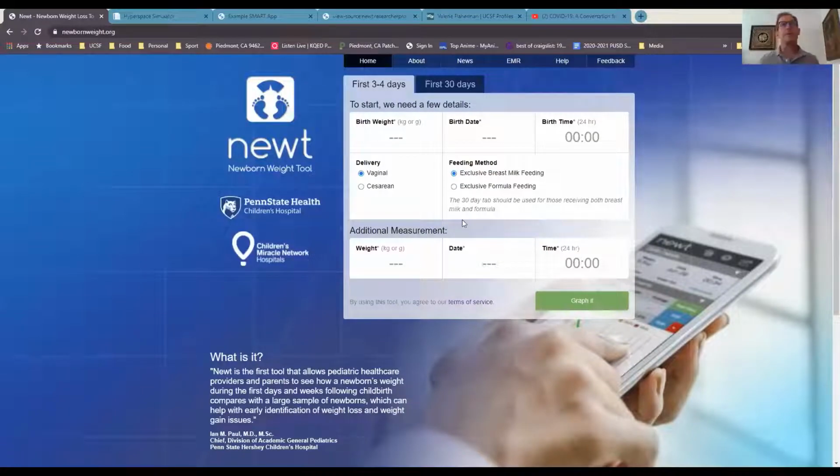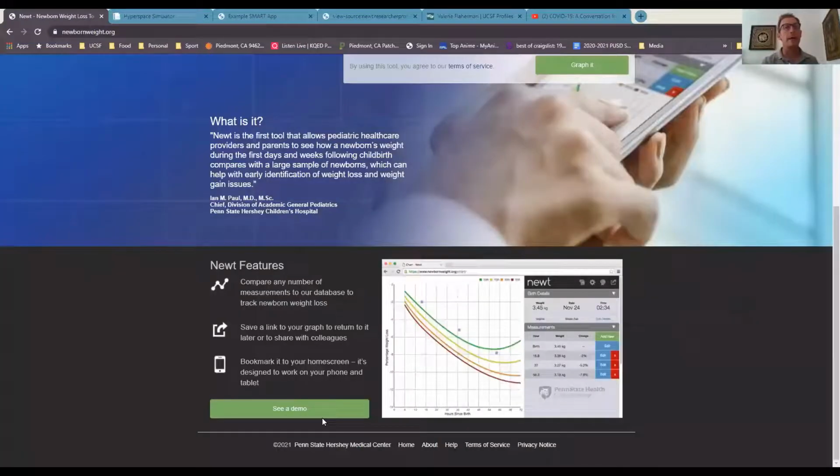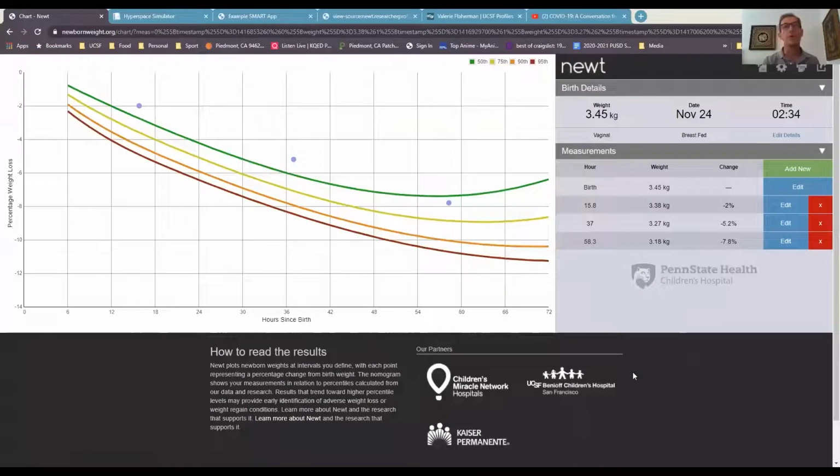What I love about this is right on the homepage, it's a call to action where they ask you to hand enter the data about the newborn. And of course, that's great as a backup, but in this day and age, come on, we shouldn't have to hand enter data. Anyone at a FHIR conference should know that. There should be an automatic way to get that in there. But before we get into that, a quick demo to show more specifically how the tool works.